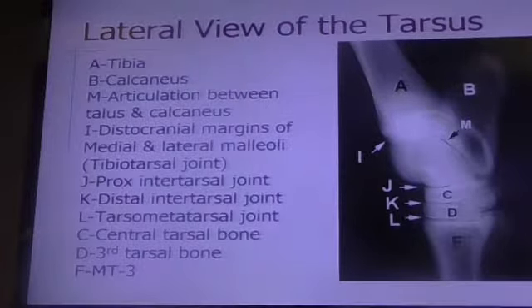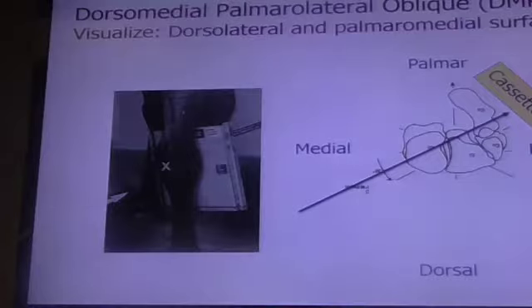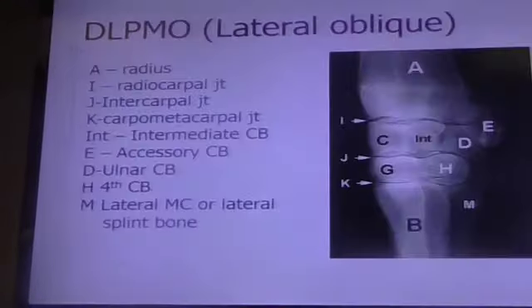Now, when you talk about the lateral view, nobody says this is a lateral medial view, if you're talking about the entrance and exit of the beam. So remember, it doesn't matter if you go medial, lateral, whatever surface the x-rays enter and exit, you can go the opposite direction and it's still the same because the two surfaces are superimposed. So we just call a lateral view a lateral, rather than saying it enters on the lateral surface, exits on the medial, and so lateral medial. You got that? Okay.